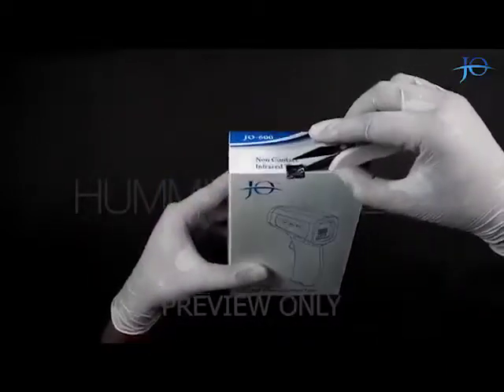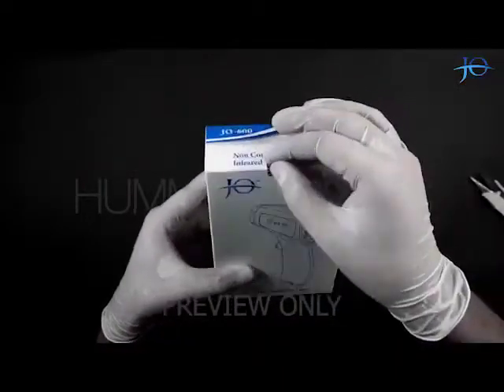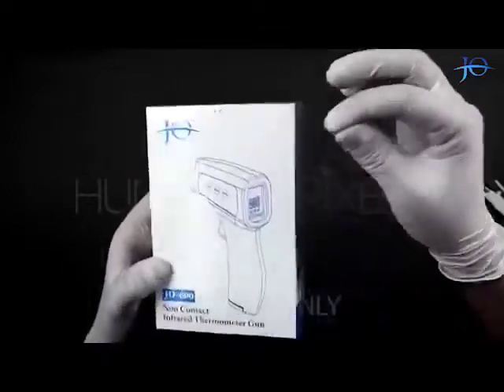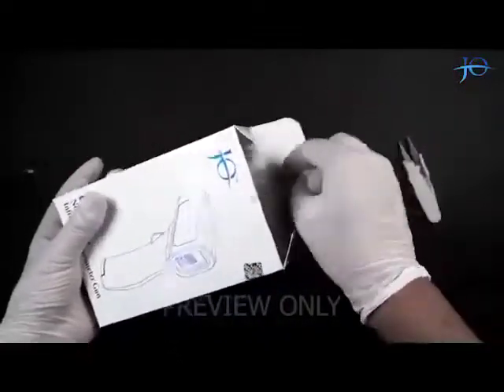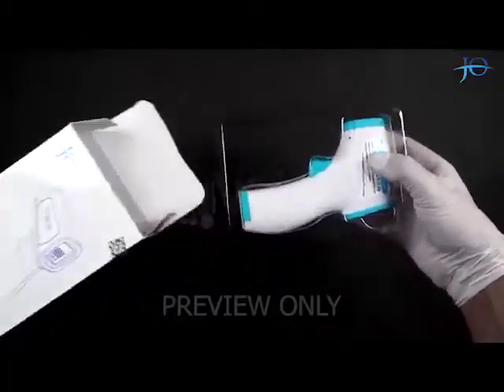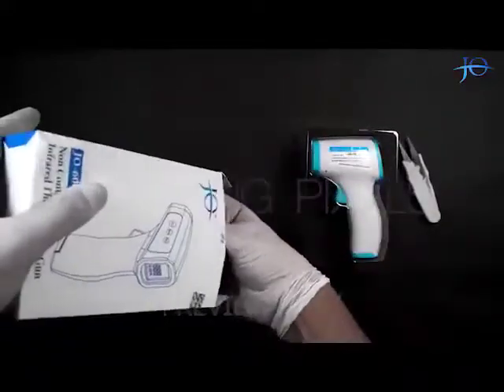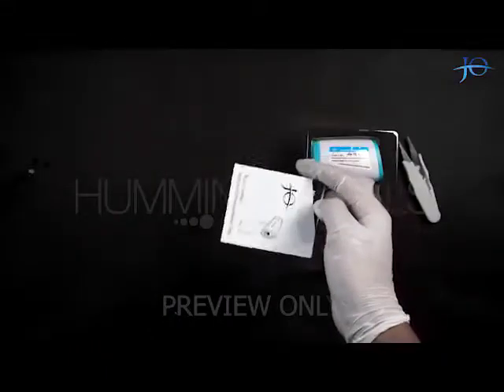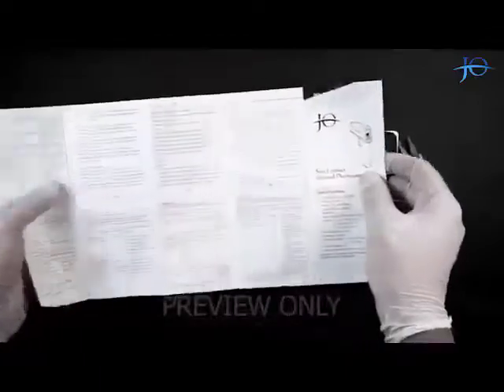Let's get started by breaking the void seal. It comes in dual colors — white and blue. The box also has a user manual in it, having all the instructions for usage and troubleshooting.